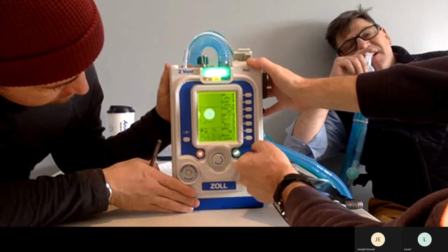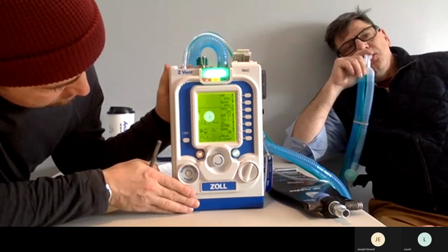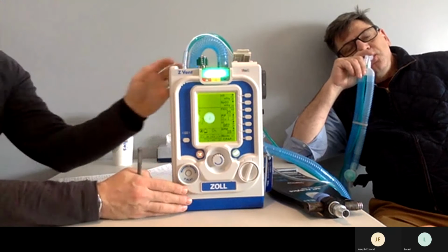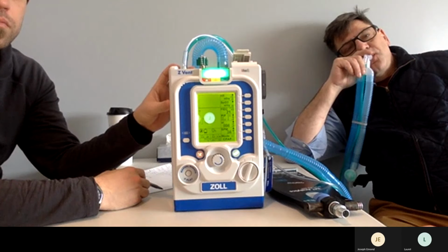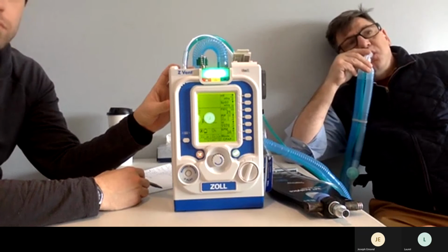Look at the graph. Look at the graph change. Oh, yeah. Going from 9 way on up to almost, it's around 18, 19. Maxed out, 18 to 21. So that's really changed around, even though you're set at 13, you're going as much as 18 to 21. Right.